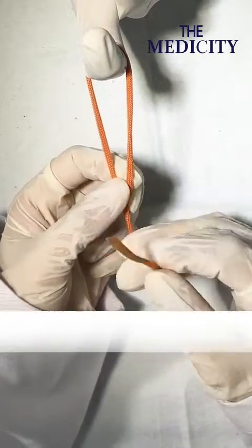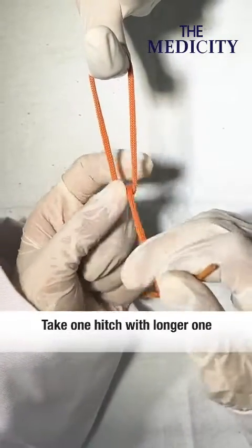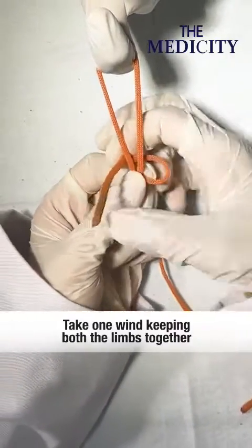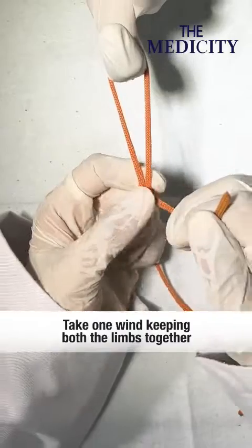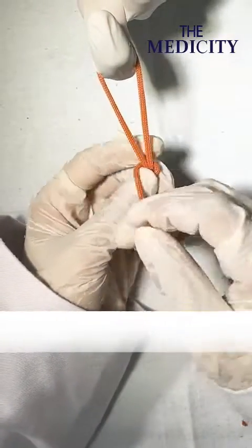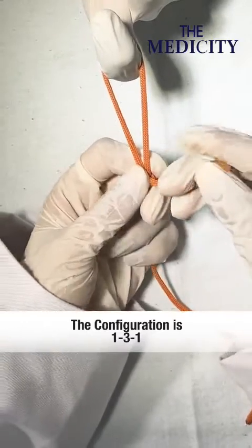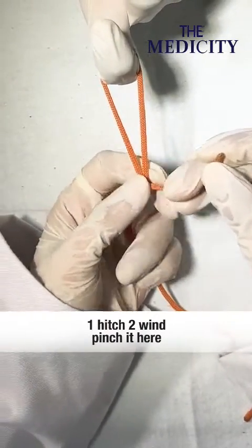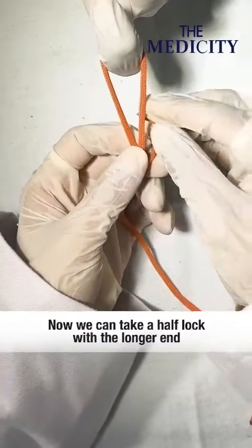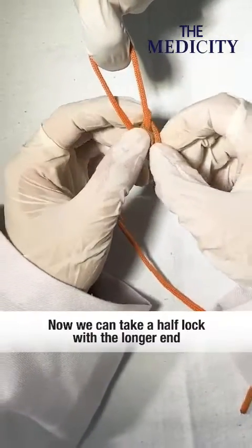Now take one hitch with the longer one, then pinch it here and take one move. Wind both the limbs together and take one more wind. The configuration is 1-3-1, so one hitch, two winds — pinch it here and one more wind. So the third wind is there.